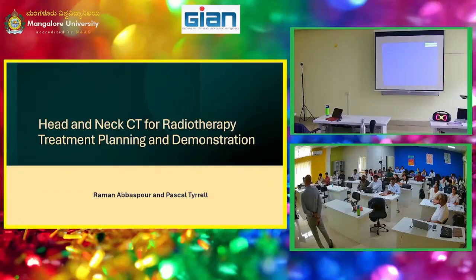About head and neck CT for radiotherapy. So radiotherapy, if you don't know, means you're exposed to ionizing radiation in order to kill cancer cells, okay? As you know, radiation can take many different forms.